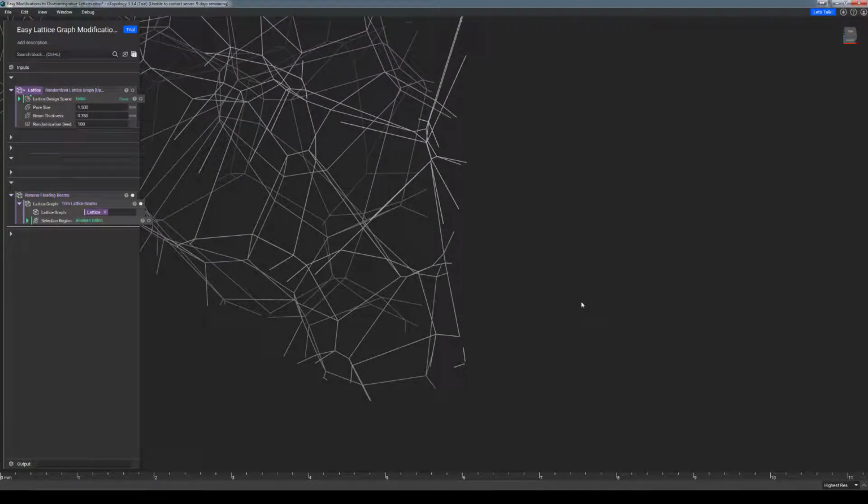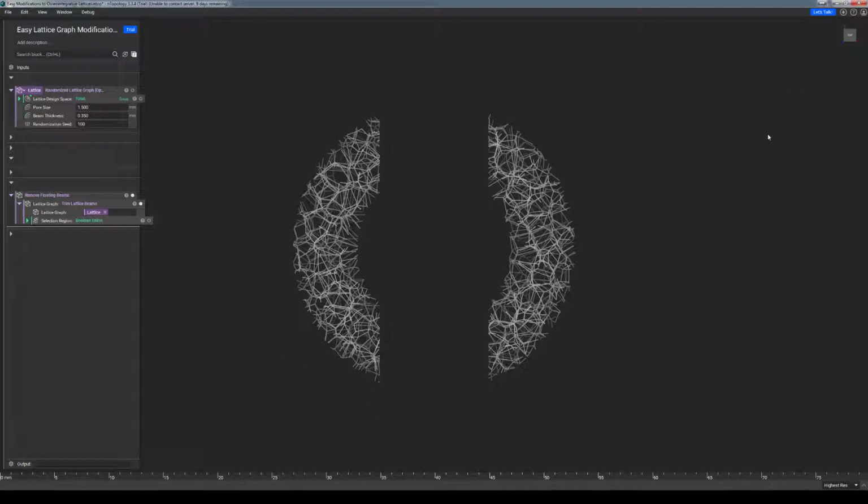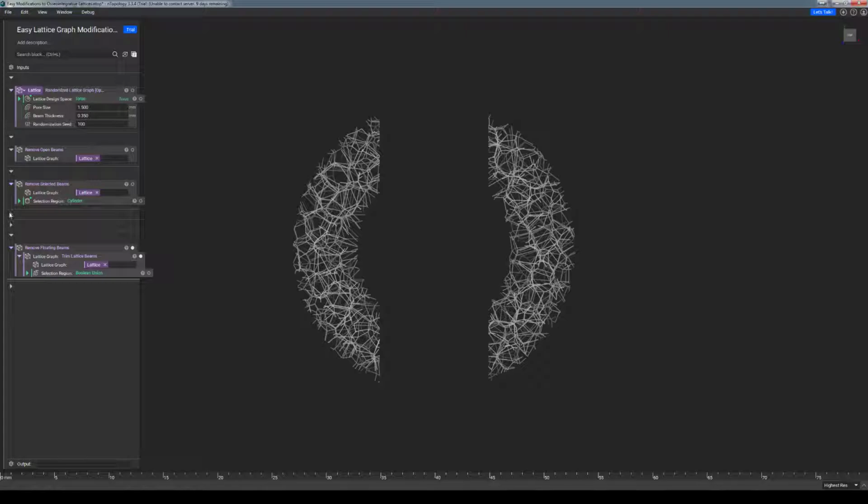If you are an experienced nTopology user, you may have already come across a handful of these native blocks that offer functionality very similar to what we have discussed today. In many cases, they do function the same way and give very similar results. But the intent behind these custom blocks is to make it even easier for new users to get on board with using nTopology to create osseointegrative structures.